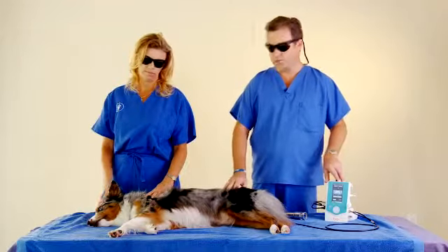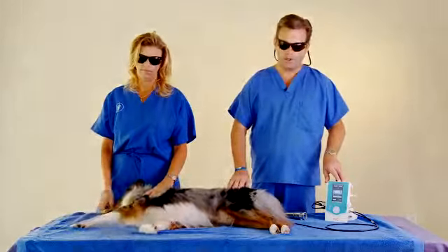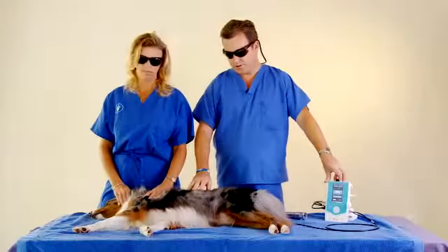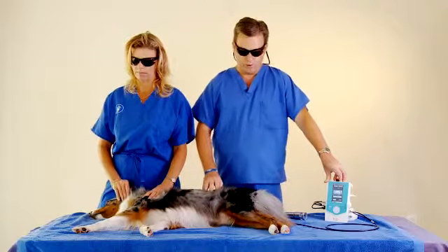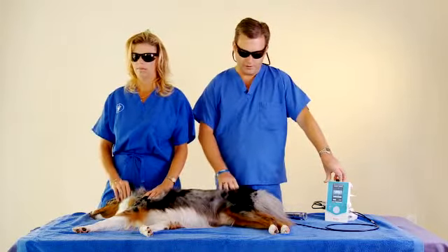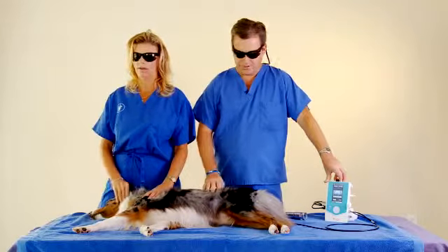So if this dog was 12 years old, you might want to cut your dosage down as far as your total joules. If the patient is not well hydrated or has poor nutrition, this will also contribute to more time to get the condition fixed with the laser.